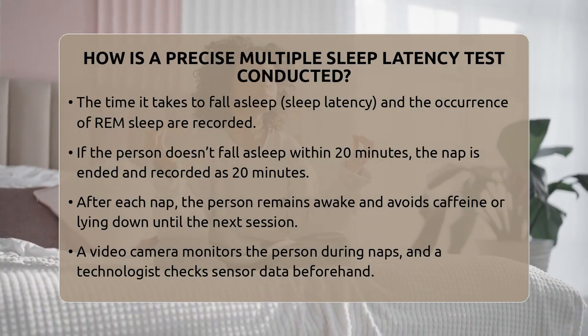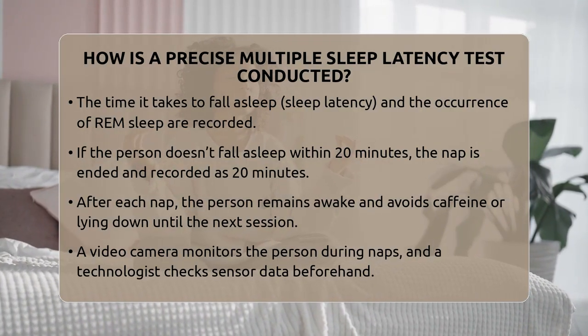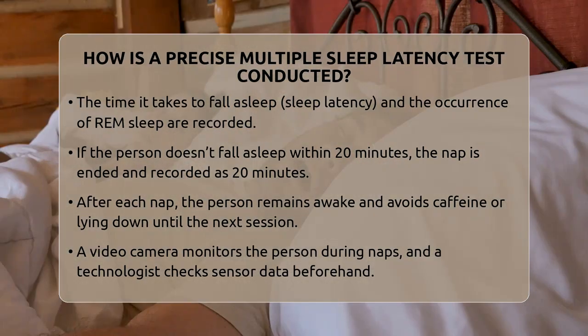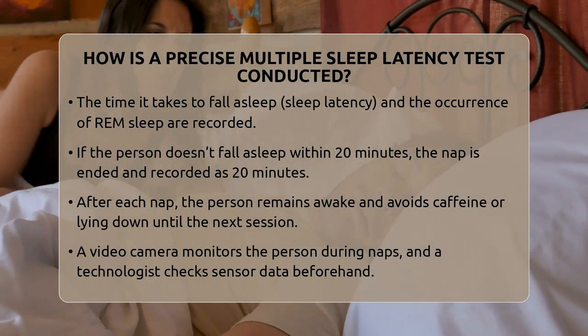If the person falls asleep, they are allowed to sleep for around 15 to 20 minutes. If they don't fall asleep within 20 minutes, the nap is ended, and the time is recorded as 20 minutes. After each nap, the person stays awake and cannot nap, lie down, or drink caffeine until the next session.